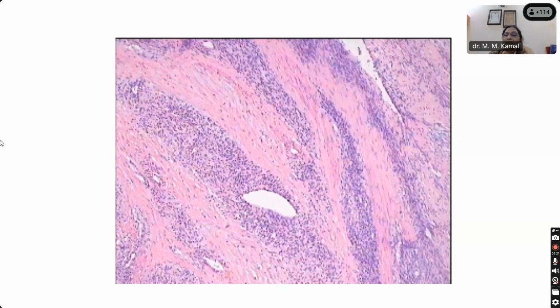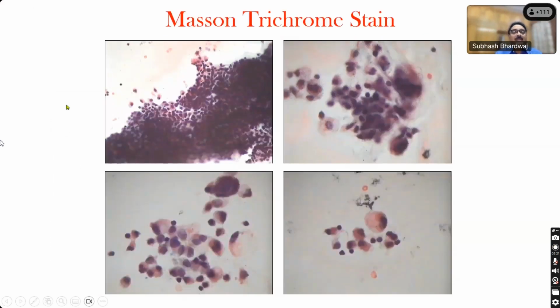Ma'am, the last case was a very challenging case, I must say. Yes, it was very challenging, because the chest X-ray appearance showed almost a complete honeycombing of the lungs. So clinically, it's difficult to say that it could be some benign entity. Exactly, it looks like a malignant case only. I just kept it because there are many details in that to discuss, and to show that the sarcomatoid variant of mesothelioma can sometimes come like this, but it's less common. The epithelioid variant is more common. So it could turn out something very different, unexpected.